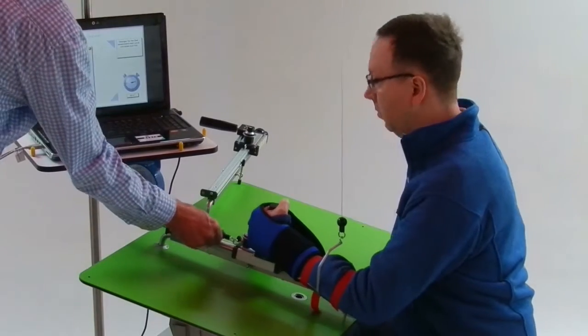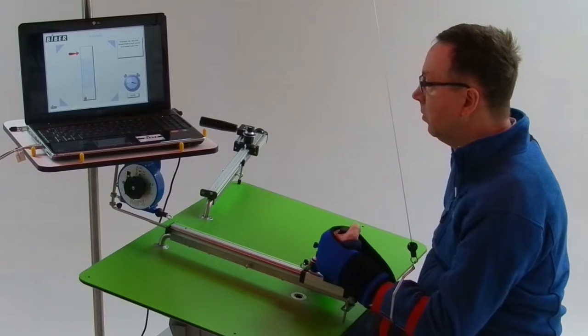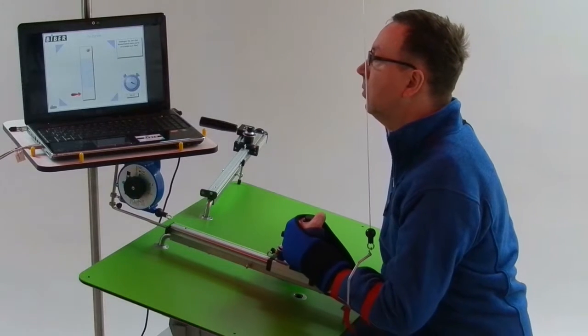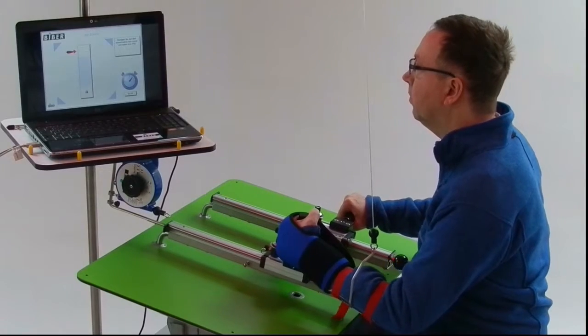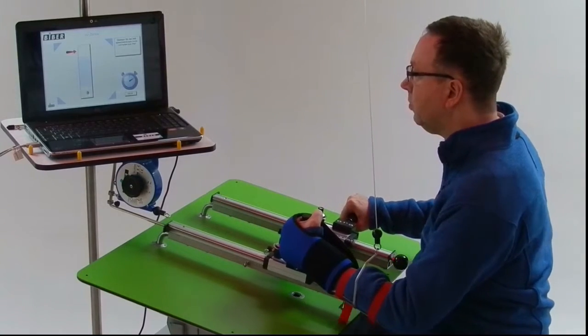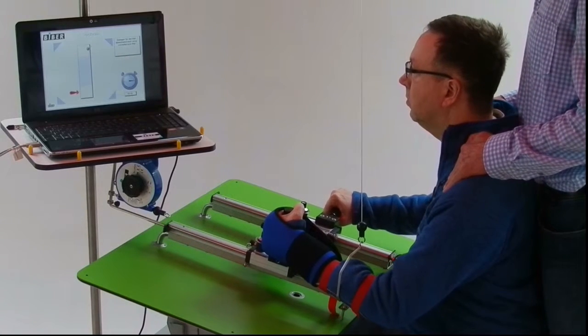The movement space of the affected arm narrows through the unhooking of the balancer. With the help of the healthy arm, the exercise can be managed more easily.